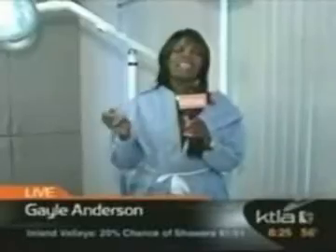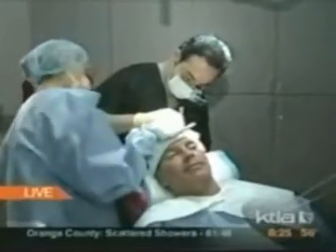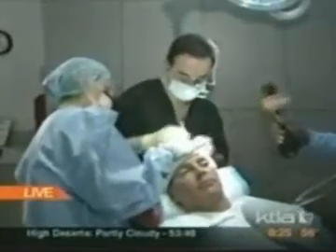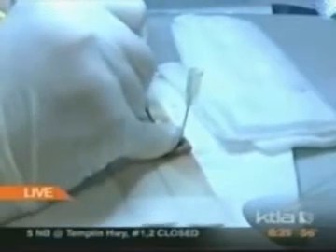We're here at the offices of Dr. Craig Ziering, Ziering Medical. We're in the middle of a hair transplant procedure with Rick. Rick, how you doing? Super duper good. Unbelievable. He is all numb. Dr. Ziering, what are you doing now? I'm creating the recipient sites. Behind Dave Lopez is the hair you have extracted from them? Yes, we took the hair from the back of the head, and now we're cutting it under the microscope. This is the microscopic follicular unit part, where we divide them into individual groups of 1s, 2s, and 3 hairs the way they naturally grow, so you don't get that pluggy look or the doll's hair that people are all worried about.